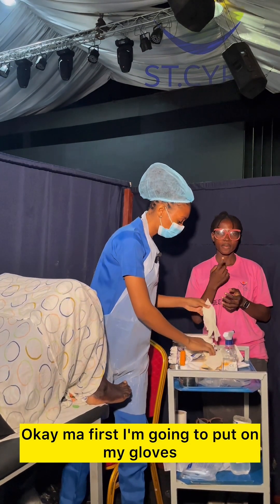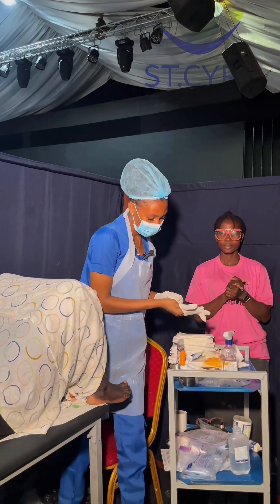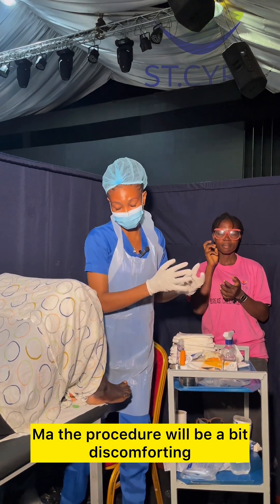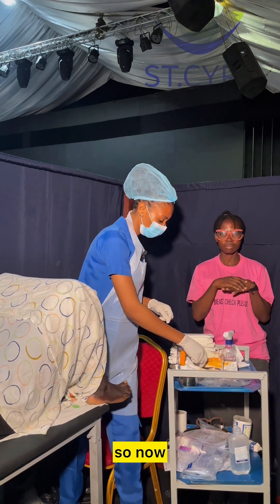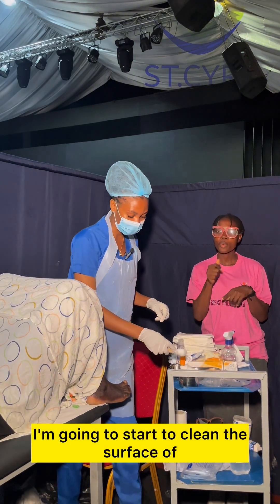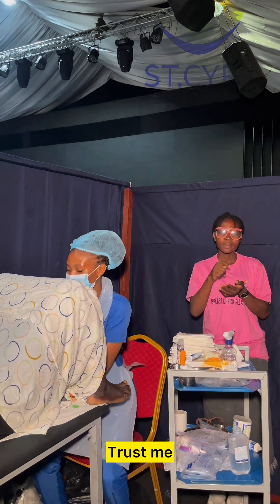First, I'm going to don my gloves. Now, the procedure will be a bit discomforting, but trust me, it's not painful. So now I'm going to start to clean the surface of the vagina.